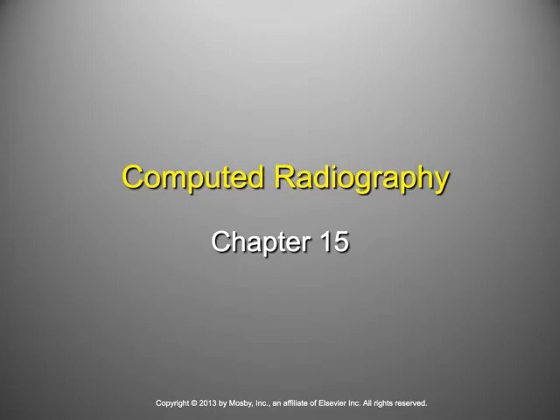In general, the big takeaway from this lecture is that given the way this technology works, computed radiography should have a lower patient dose, a lower technique than film screen radiography. And that's largely because we can turn up the kVp and turn down the mAs and get the same basic image. One thing to look at before we get into the lecture proper is on page 283 in our textbook.